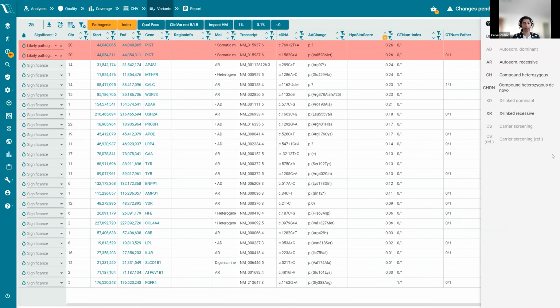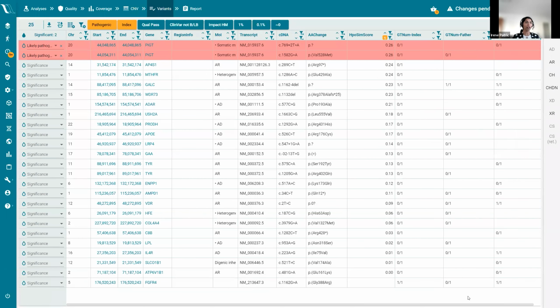So that at a later time point, when I have to revisit this case, either me or a colleague of mine who would like to know how I went about this case, it would be easier to see what was applied and what the results were at that point of time. So as I mentioned earlier, also with annotations, there could be changes with the data as such, with the classification and so on. So it would always make it easier if there is some way to see the history of users. So this makes it quite easy. And also when you have nothing, it's also easy to say that you had nothing when you applied such and such filters.